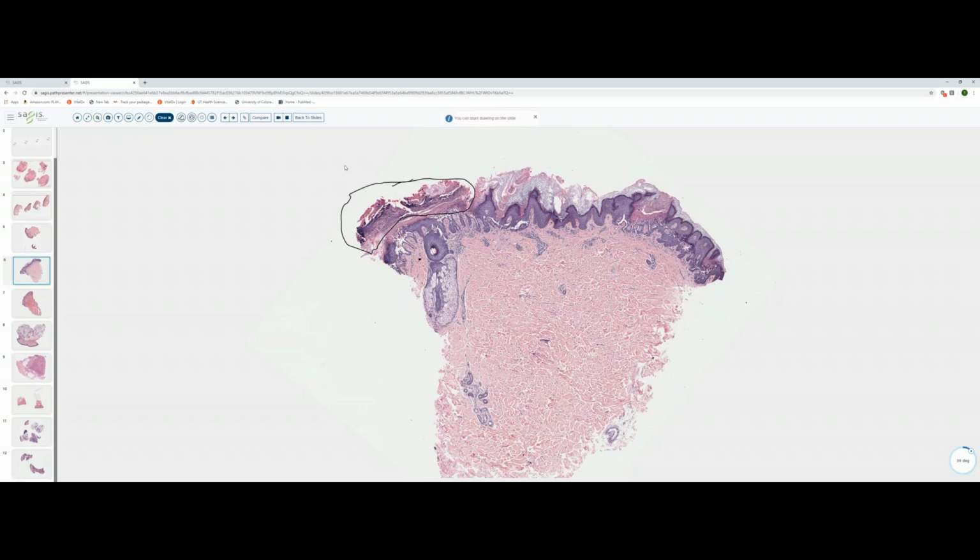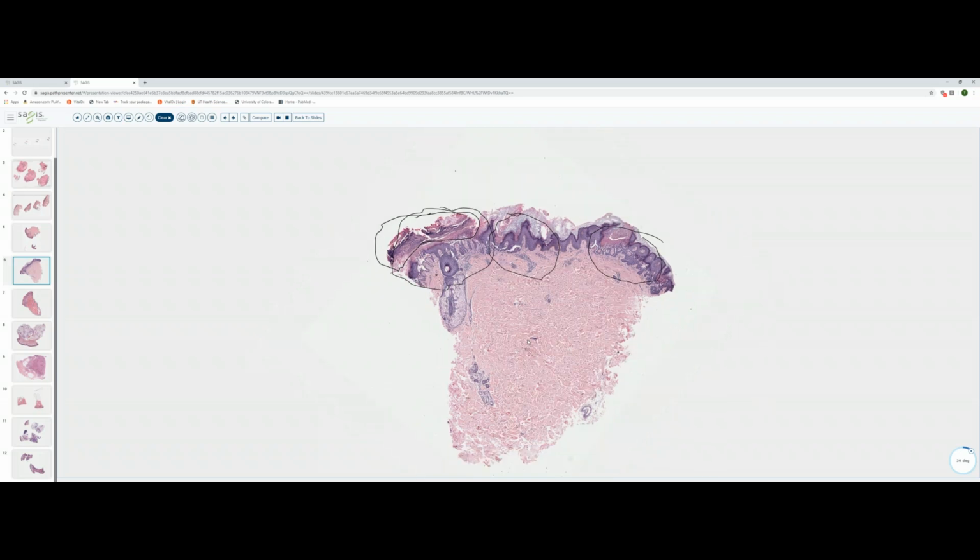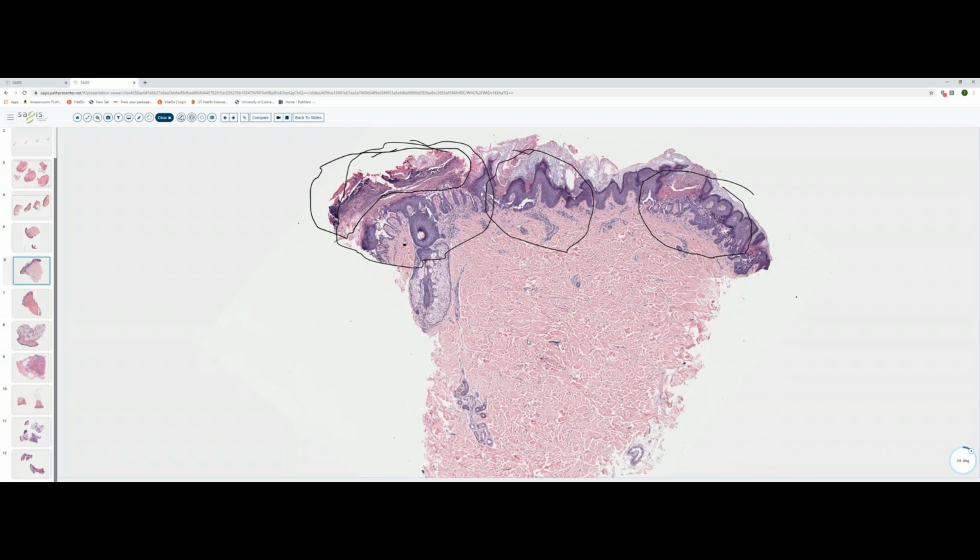Darier's disease. Darier's disease is characterized by close set papules that become confluent and form plaques. If you look here, it's almost like we have three adjacent discrete foci of suprabasilar acantholysis with dyskeratosis. So I'm sure this was taken from a plaque of Darier's, and we had three very close set papules. So this is an example of Darier's disease, but the differential would include Grover's.